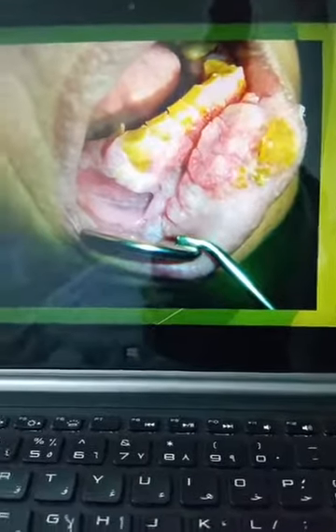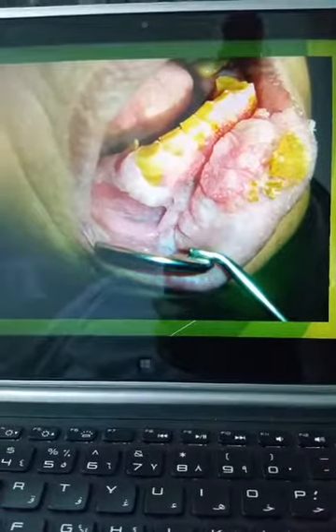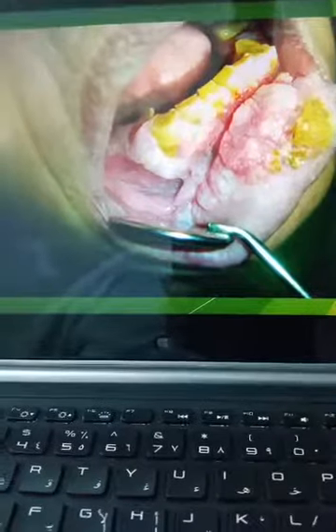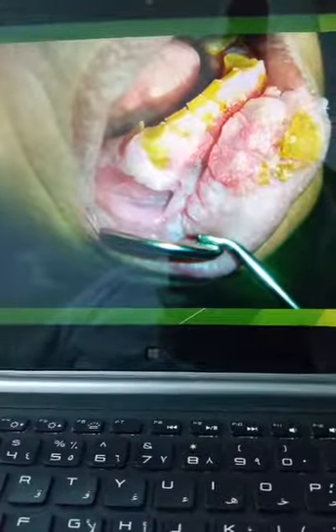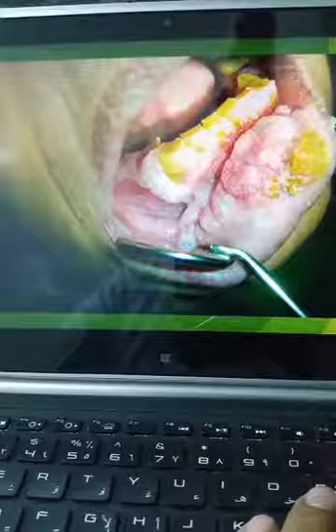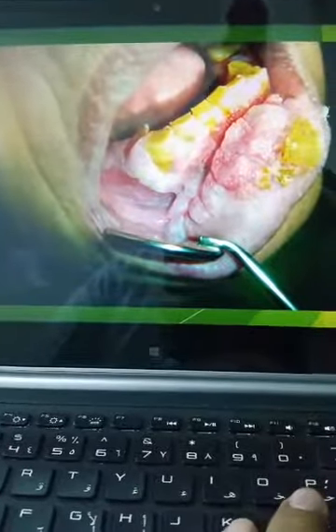This lady was in a military hospital, and they could not treat her under general anesthesia because of her heart condition. So therefore, she came to me, and I was able to remove this under local anesthesia with CO2 laser. Here, I should use CO2 because it is fast and we have not much bleeding, and I have to send this also to histology if I need.